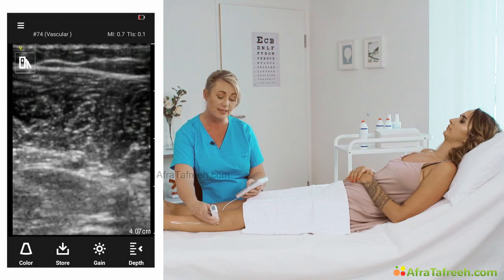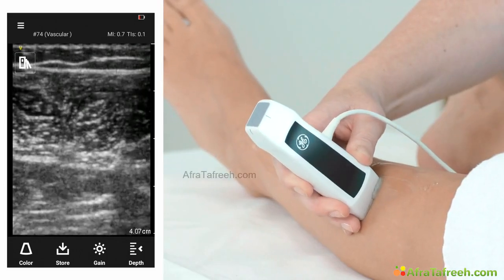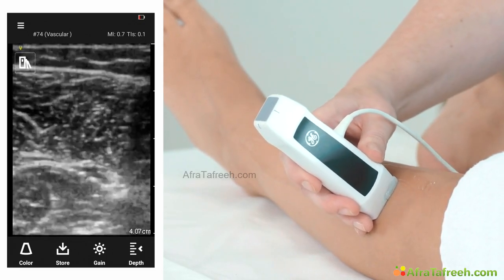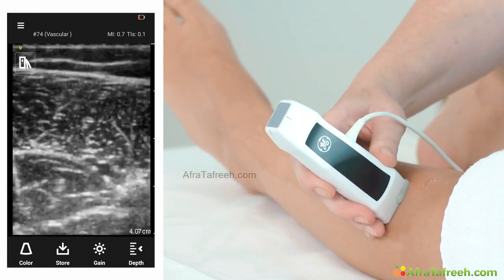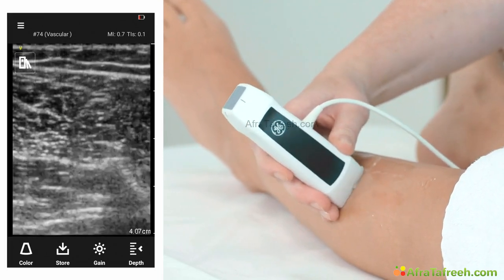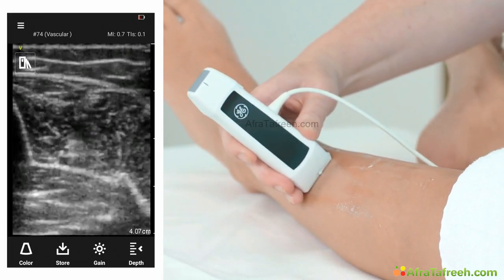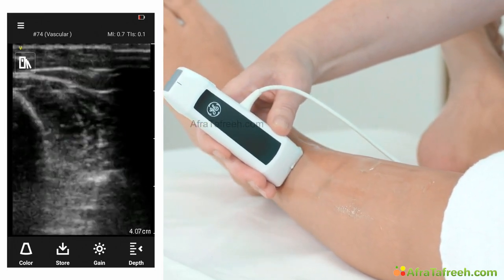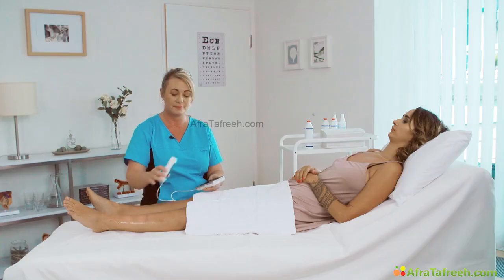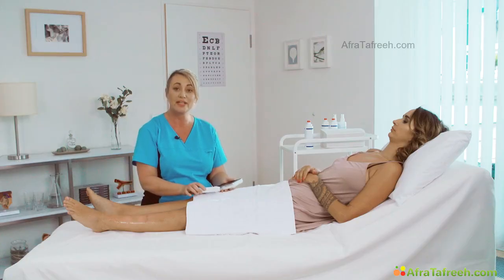Compression, and you can see the two tiny little veins there compressing on either side of the artery. We're going to continue our compressions as proximally as we can here, and then distally, again compressing every centimetre along the way. The veins get very small here down at the ankle, so we might stop about this position here. So now that concludes our entire left leg DVT study from the groin to the ankle using 2D compression imaging.